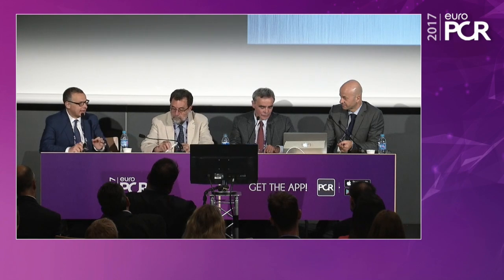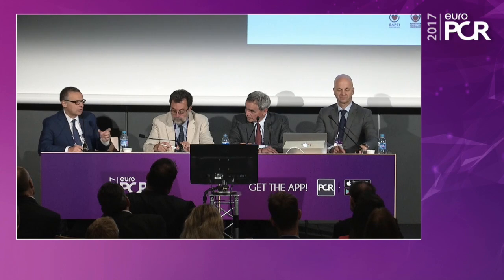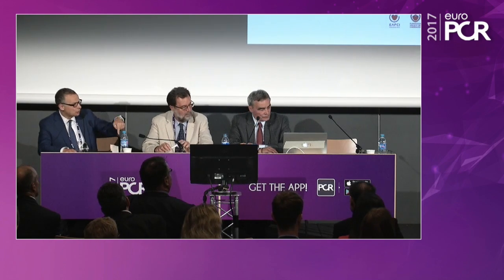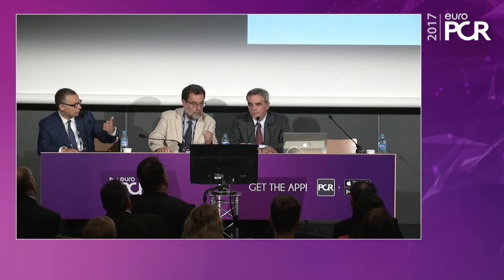Compared to other procedures, this is one of those procedures where we can get a lot of information from surgery. Not everything, but it's very close to surgery. As much as the tricuspid valve is concerned, all tricuspid rings cover the circumference of the annulus also in the region of the septum, so they go 2 to 3 centimeters in the direction of the AV node. So we in surgery avoid putting sutures from the septo-anterior commissure 1 centimeter towards the coronary sinus. And in my practice, I do this always on beating heart, because if I get some electrical feedback, I will stop. I will not go in that direction.